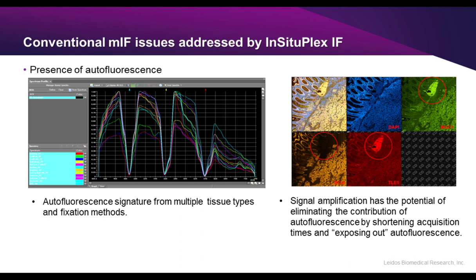If you just need to get density of, say, CD3 cells, it really doesn't make a whole lot of sense to throw in several markers, tens of markers, onto a slide. That just makes the process more cumbersome, labor-intensive, costly potentially, and you're really not getting an advantage.